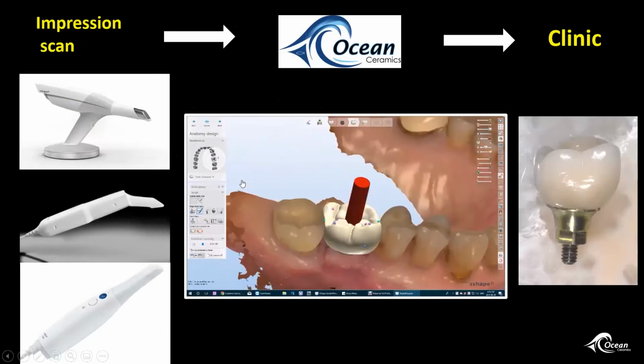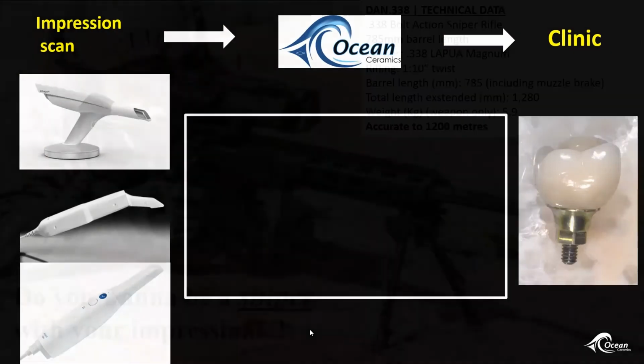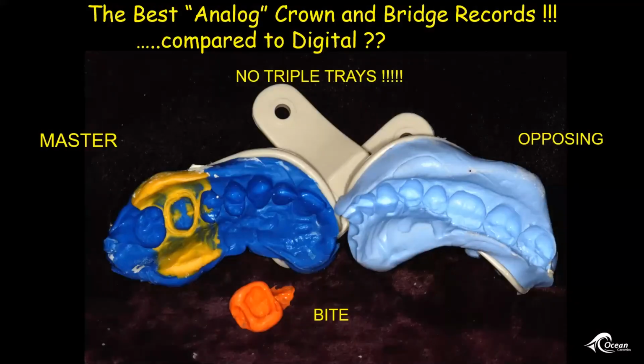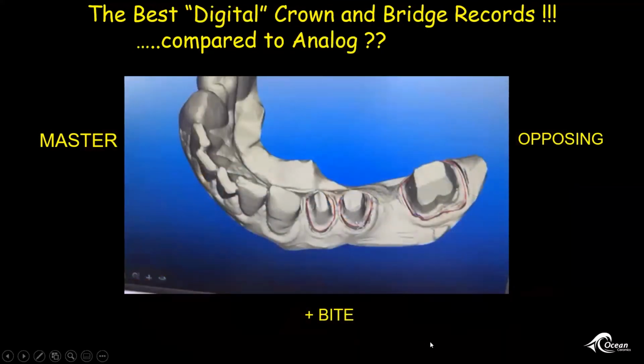Okay, this is a nice little implant case we did. I want to go back to, you want to be a sniper with your records, hitting the bullseye with your impressions. That's the goal for when we're talking about accuracy through our talk today. So back to the best analog crown and bridge records compared to digital. This is our master opposing our bite record. And now I'm going to pass the torch over to Steve because he's going to be talking about being a sniper as well.